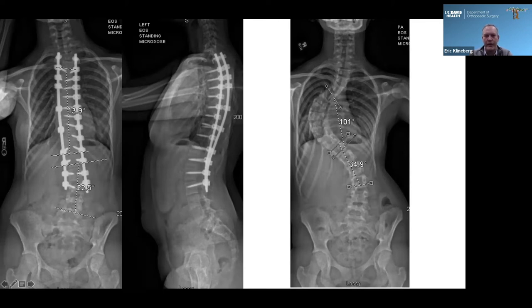All right, that was great. Thank you very much. I don't think you mentioned the last step is usually locking those hooks. You leave a lot of pressure off those until the very end. Just make sure you're not overstressing those. Yeah, tighten those. That's a good point.